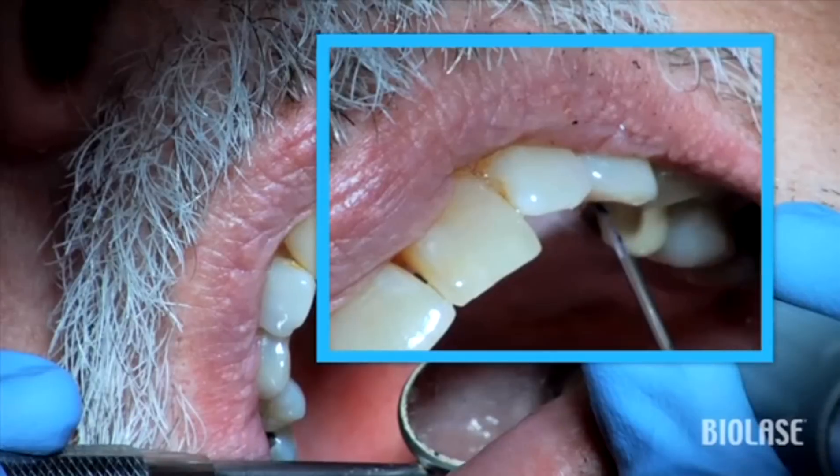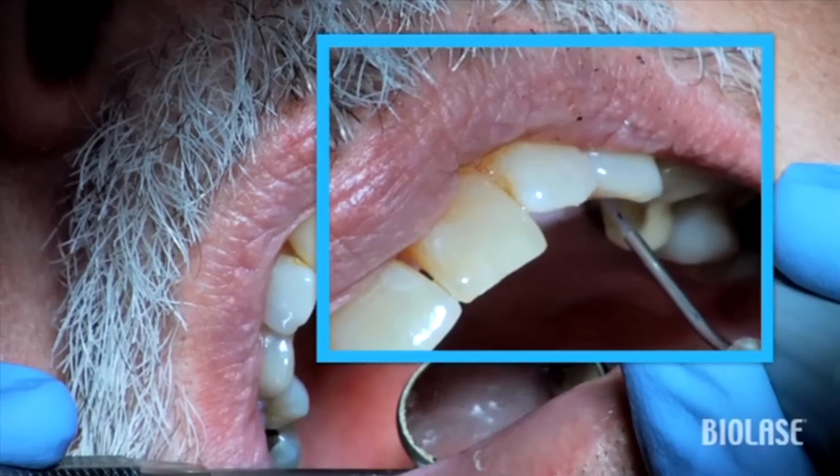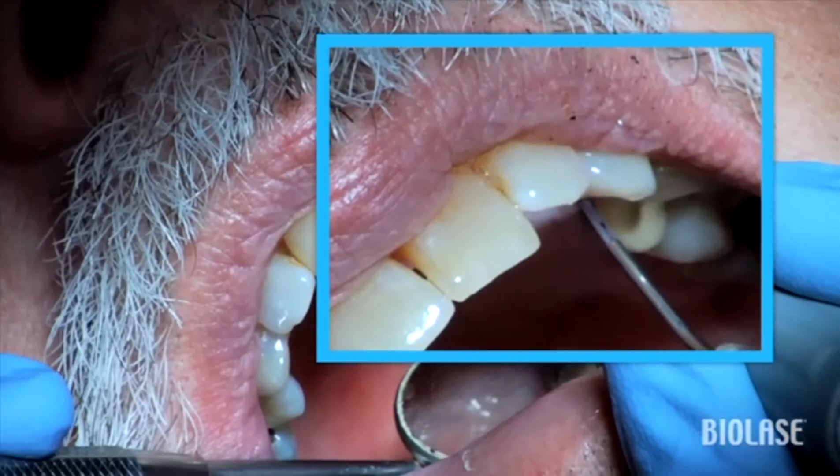Laser sulcular debridement provides increased comfort after scaling and root planing, no anesthetic in most cases, and reduction in pocketing.